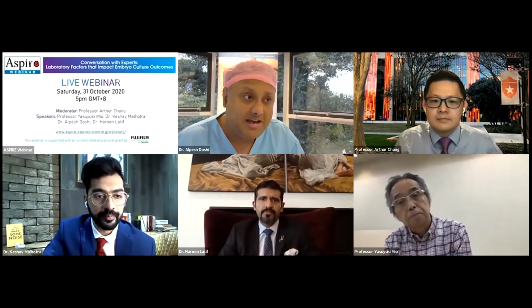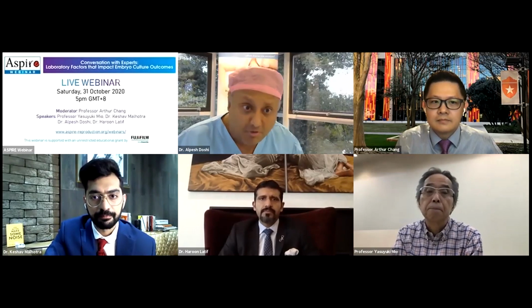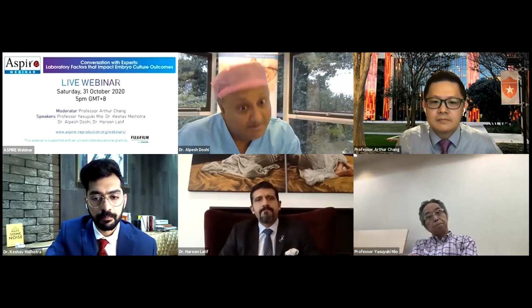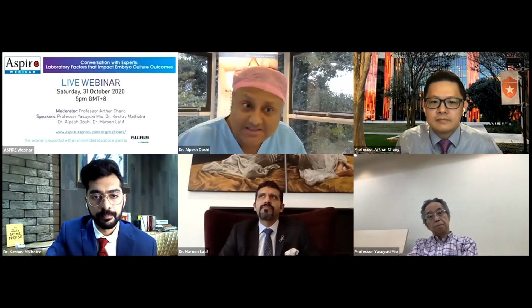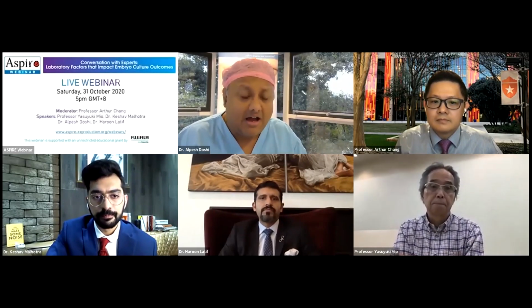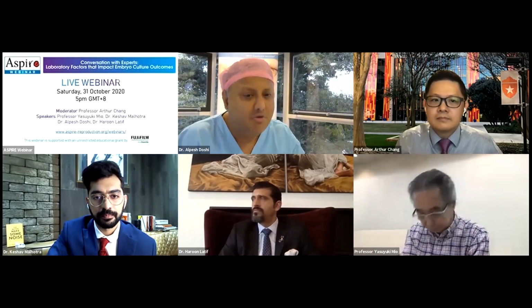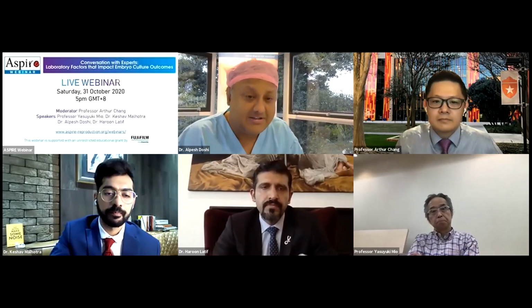And with non-invasive PGT-A, things are moving on quite well. I believe that we are pretty much at 86% concordance at the moment with non-invasive PGT compared to invasive PGT. However, we need the concordance to be higher. We need it to be at around 95, 96 before it is clinically applied. However, groups have suggested that with non-invasive PGT, you are getting more DNA from the inner cell mass and not the trophectoderm, which will hopefully give us a much more concrete clinical diagnosis, because we are going to be getting a lot more DNA from the inner cell mass rather than the trophectoderm.